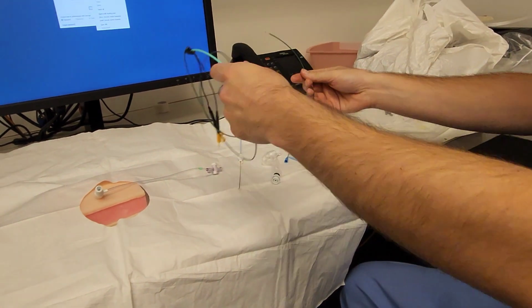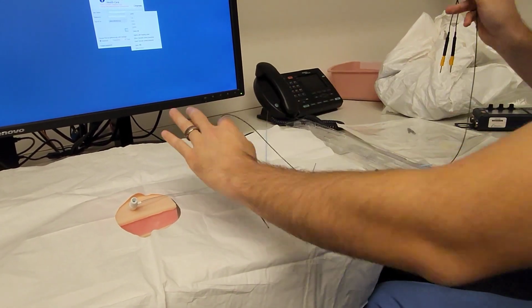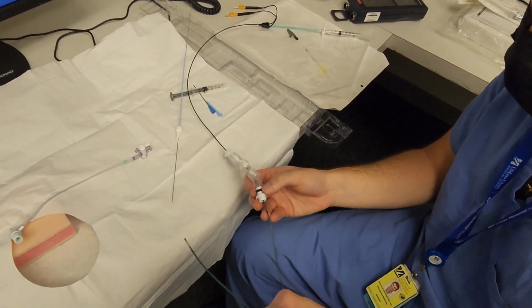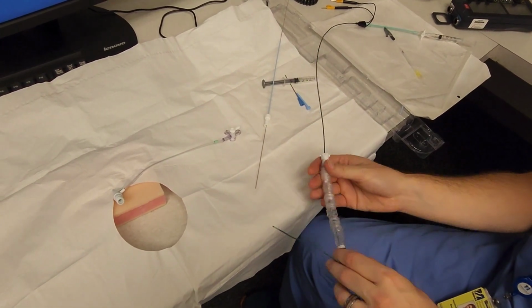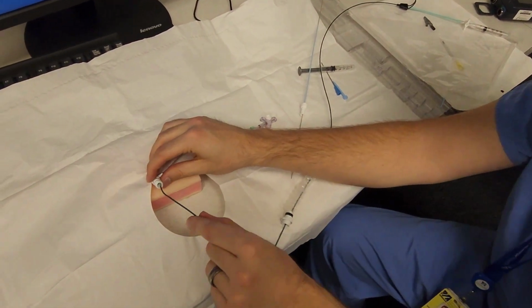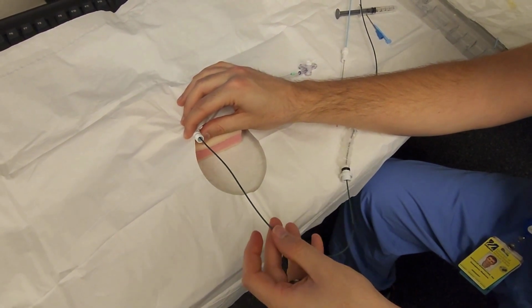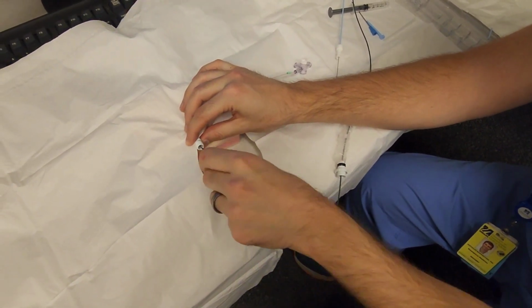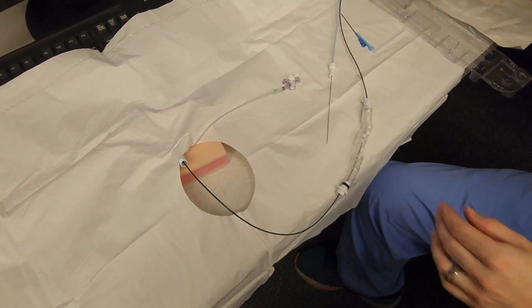you're going to get your pacer wire. Test your balloon. Before inserting your pacer wire, make sure you put it over through the sheath with the end that screws on distal. Then take your pacer wire, start to insert it. Each bar represents 10 centimeters. So we're going to go to 2 black bars, so 20 centimeters. At that point, we're going to inflate the balloon.